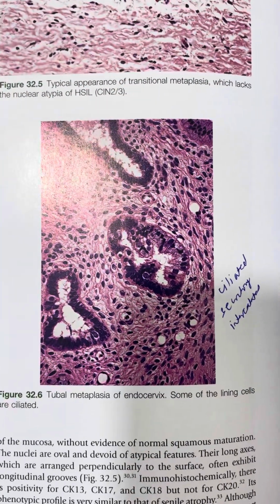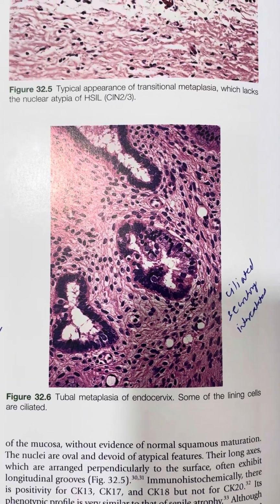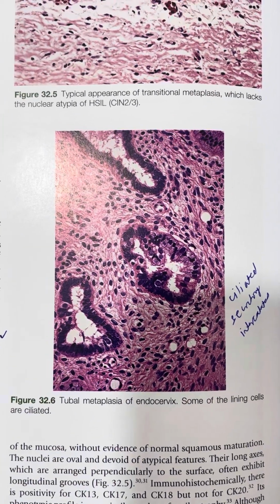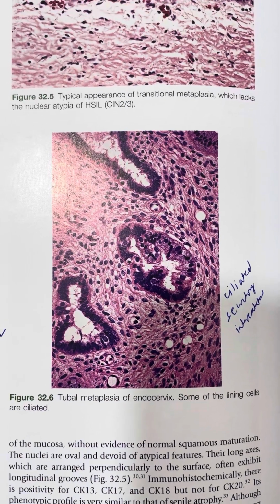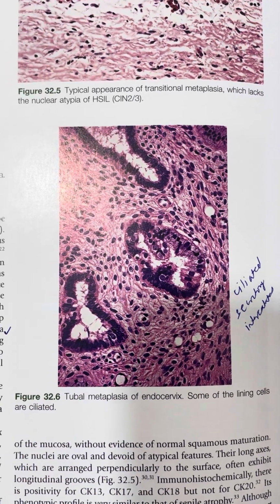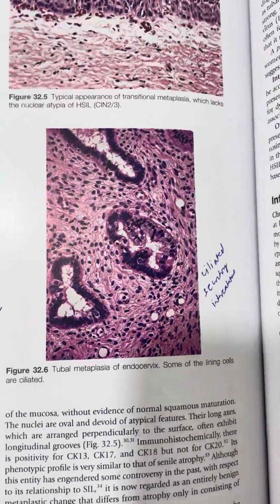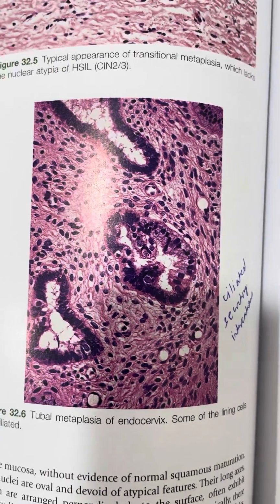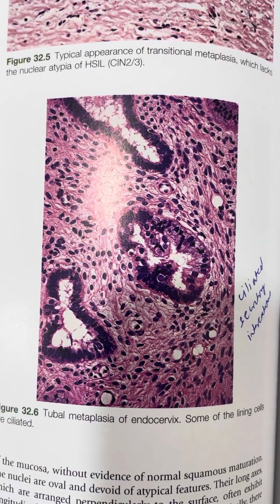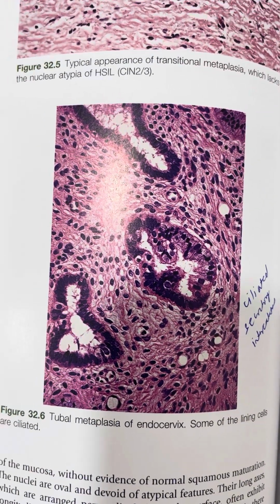Then the next important condition is a tubal metaplasia of the endocervix. That is, the endocervical glands become tube-like, having ciliated, secretory and intercalated cells. Sometimes it can be tubo-endometrial also. Then how to differentiate? Again you have to do the P16 and the Ki67.